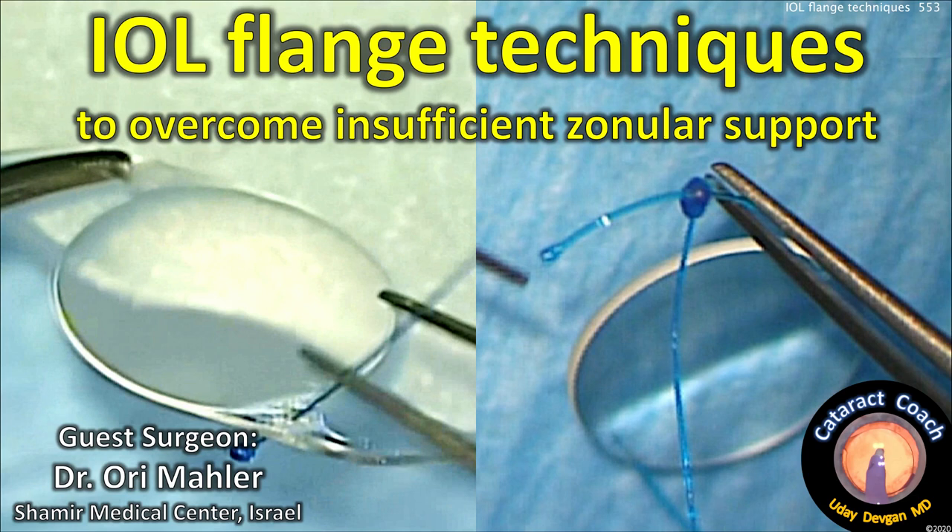CataractCoach.com. IOL flange techniques to overcome insufficient zonular support. Guest surgeon is Dr. Ori Mahler from Israel.